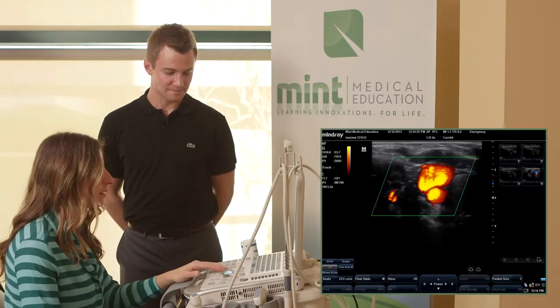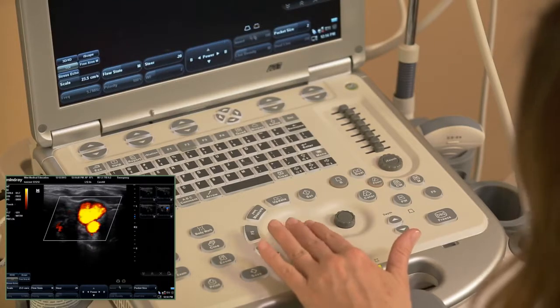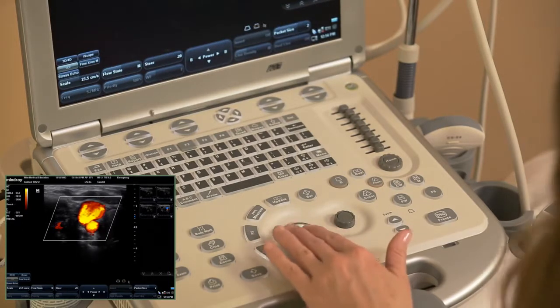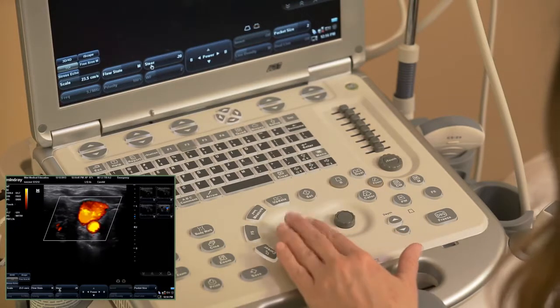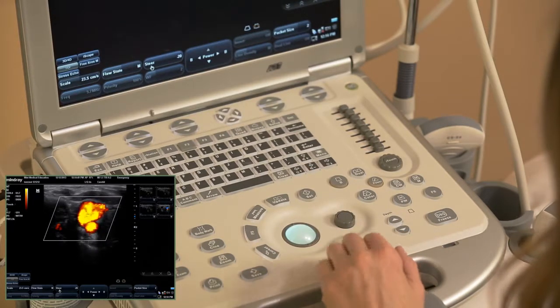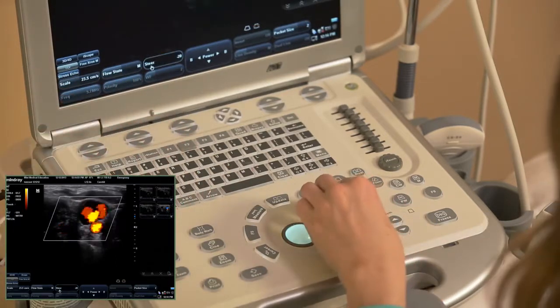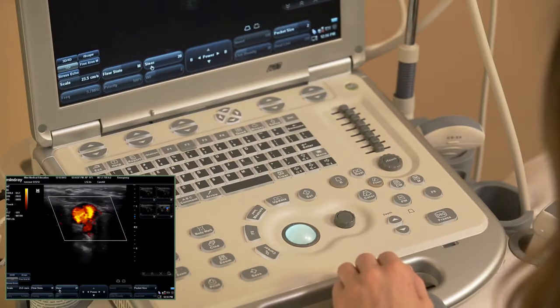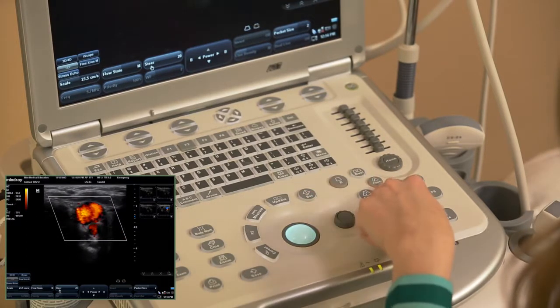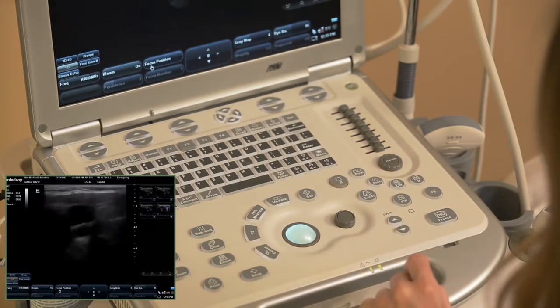And basically the soft keys here are similar to what it would be on color Doppler. Correct. And you can change them the same way, and steering would be the same. Yep. Okay. And again, you can use the soft keys as you would up here, or you can use the trackball and the set key, or you can also use the trackball and the rotary nav multifunction key. Nice. And to get off, you can either hit the power button or you can hit the B. Correct. Yep. So you can bring it back to the B mode there.